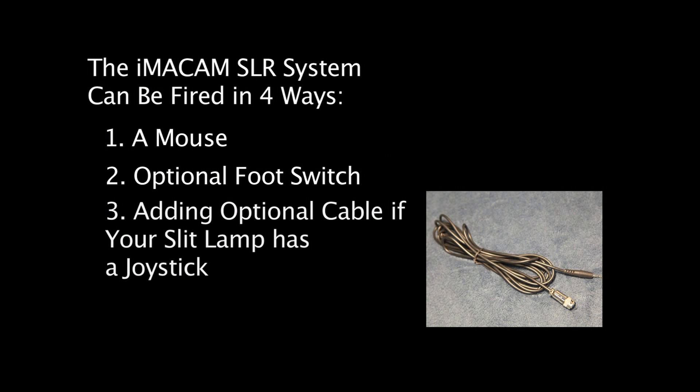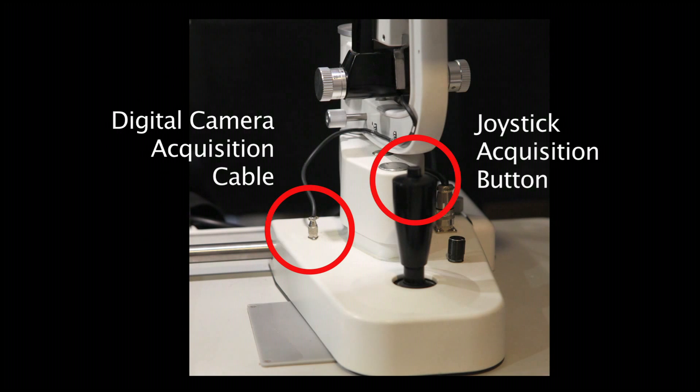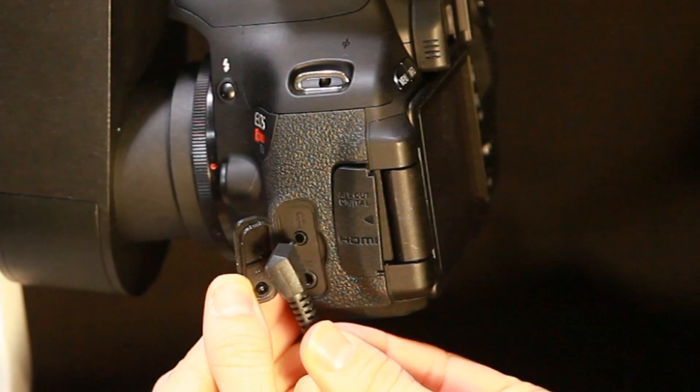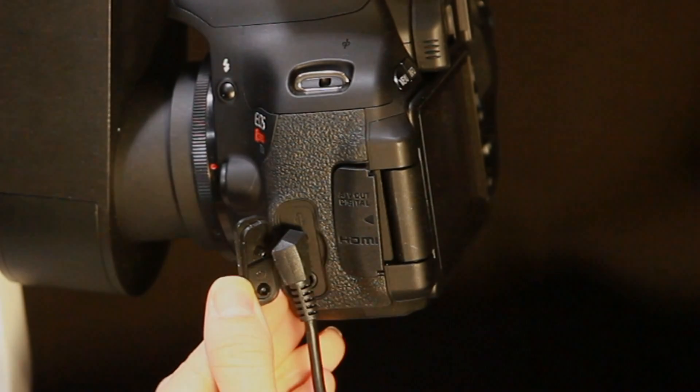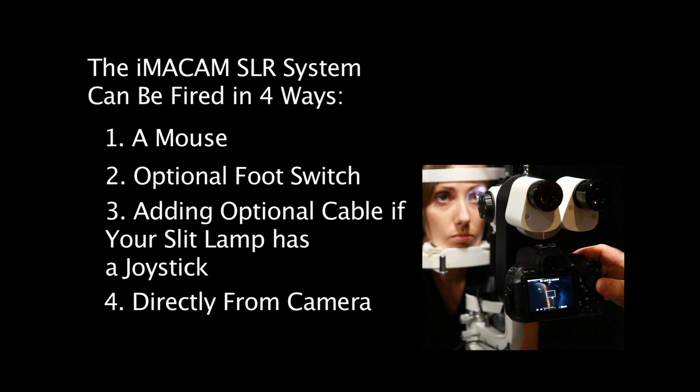Third, by adding an optional cable if your slit lamp offers a joystick connection. And here's how that connection is made with the digital camera. And fourth, by firing the digital camera directly.